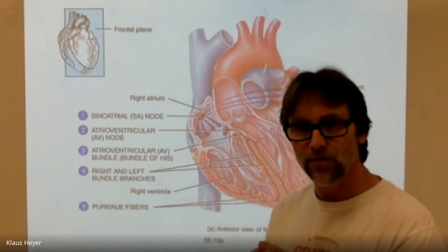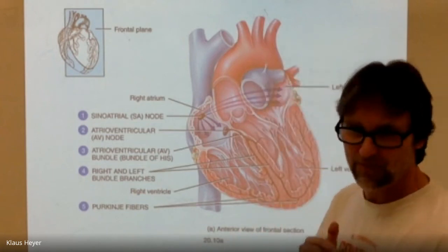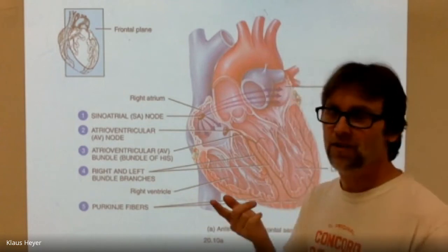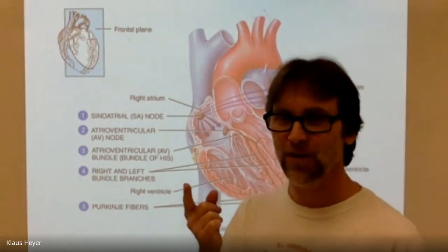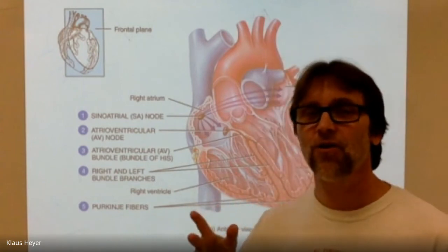So when they're using those, it doesn't bring someone back from no heartbeat. It doesn't work. It only works on two things. It works on something called VFib, ventricular fibrillation. I can never say that word. And then VTAC, ventricular tachycardia, when the heart.